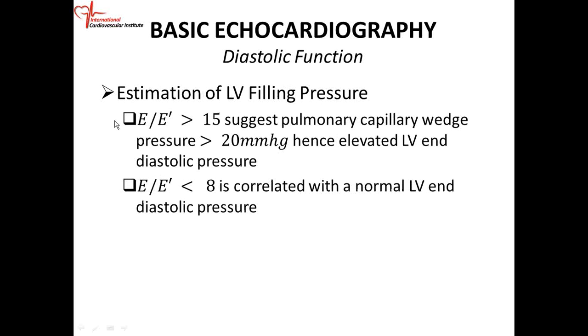Okay. We also use the ratio of E to E prime to assess left atrial pressure or LV filling pressures.